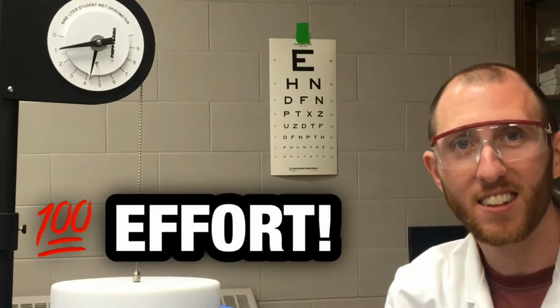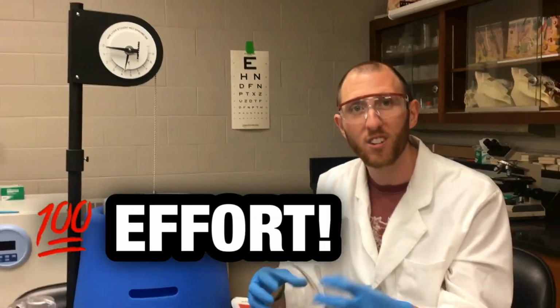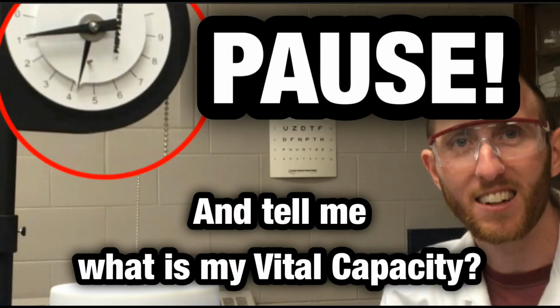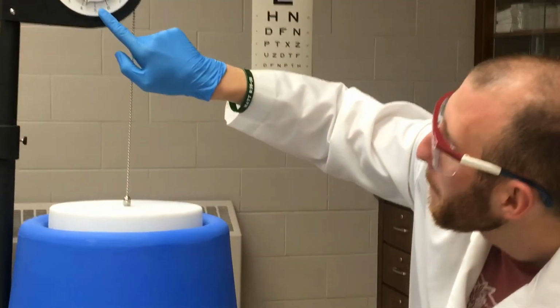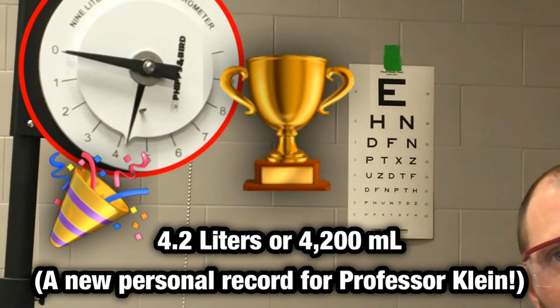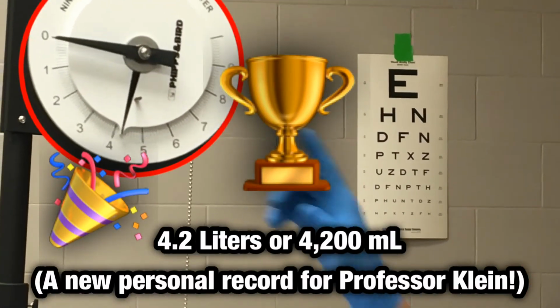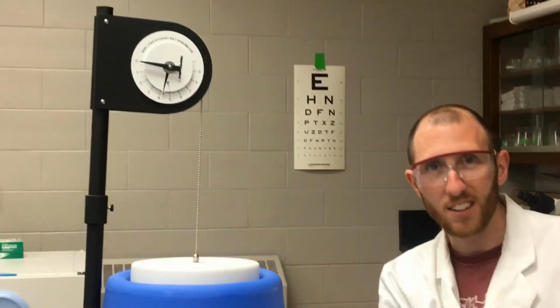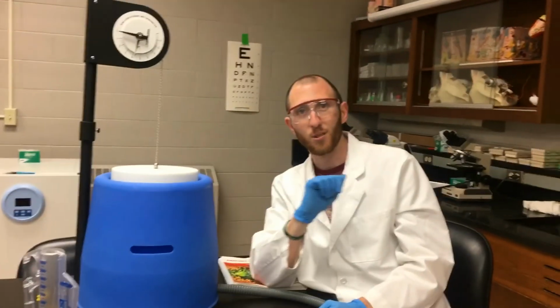That's everything I had in my lungs. I had to force out into this tube. And if you look, it's 4.2 liters or 4,200 milliliters, and that would be normal for a male. Check the ranges in your lab manual to know the normal ranges.